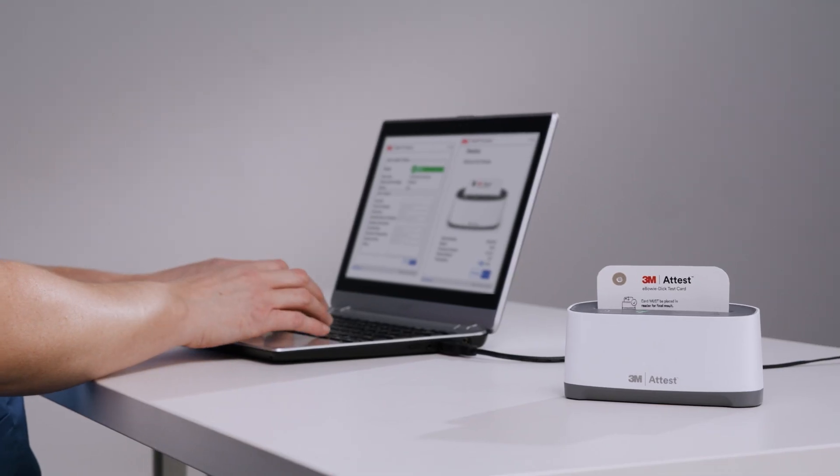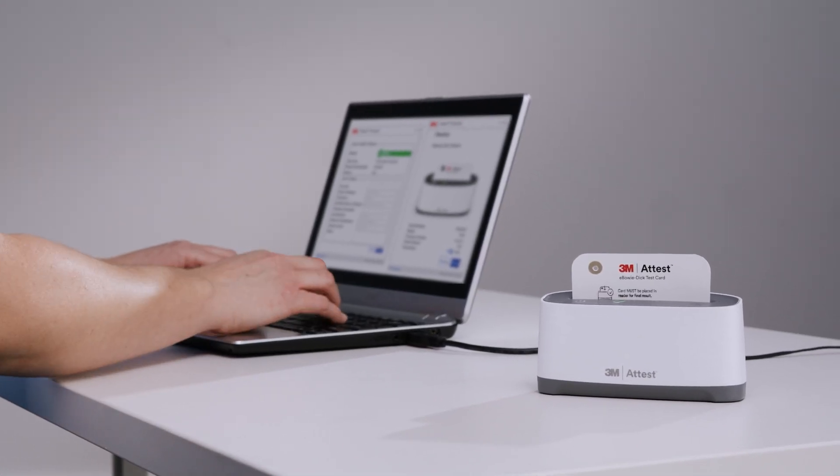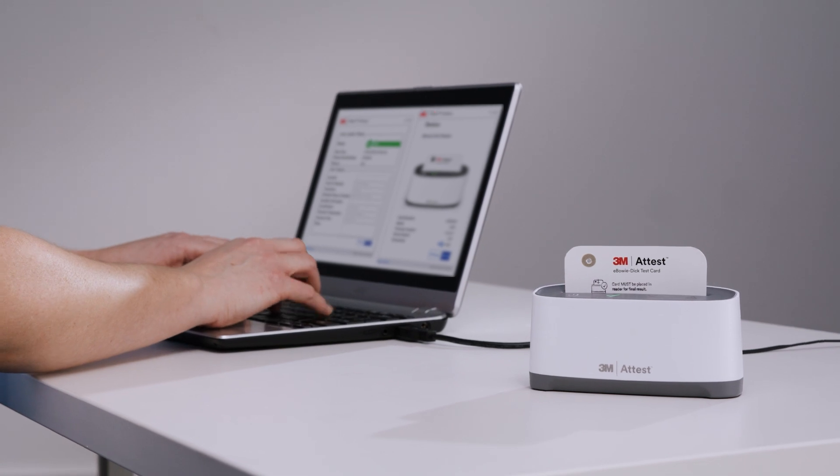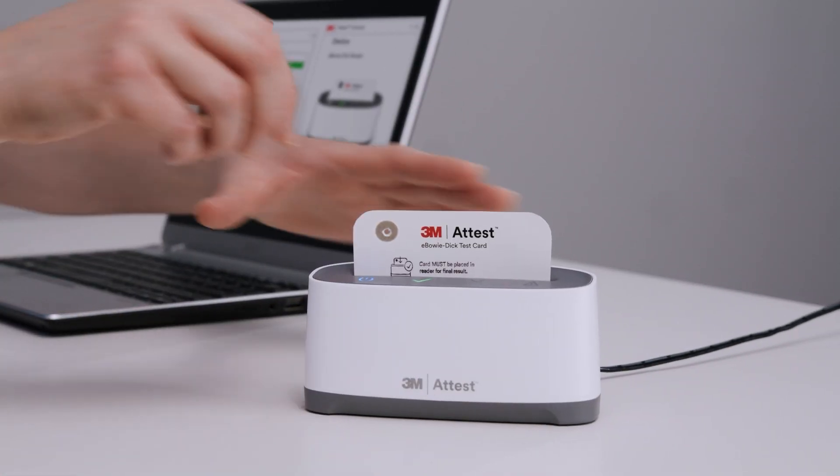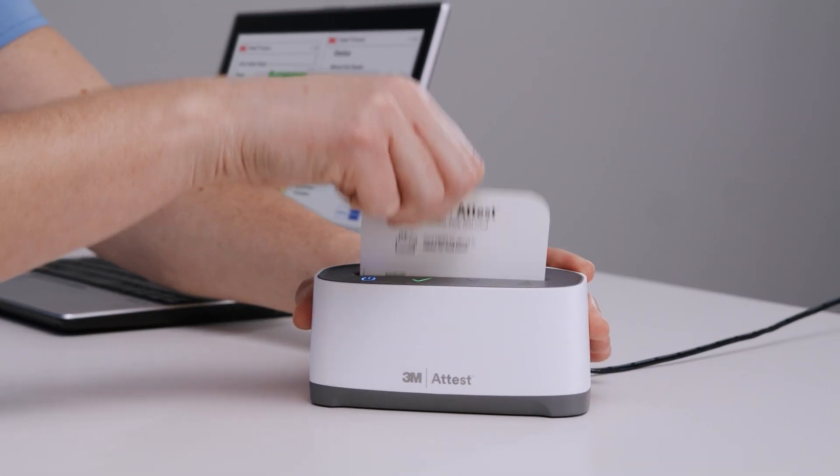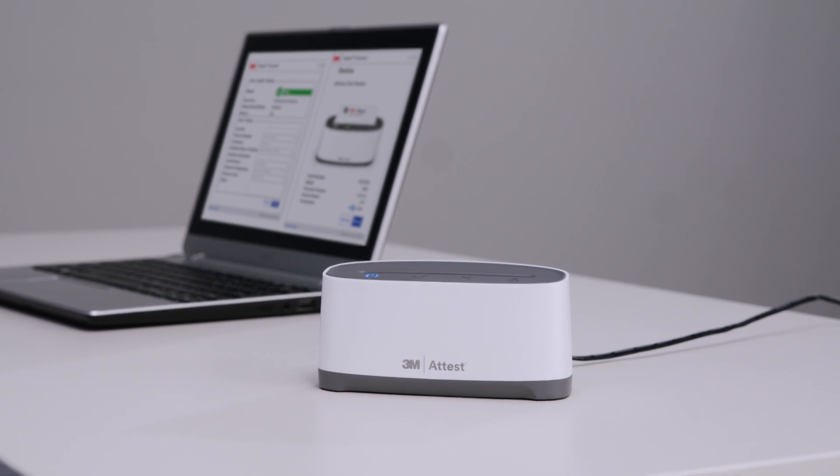Congratulations! You have successfully stored your test card results into the 3M Attest Connect PC application. You can now remove the test card from the auto-reader and insert another card, or you can close the app.